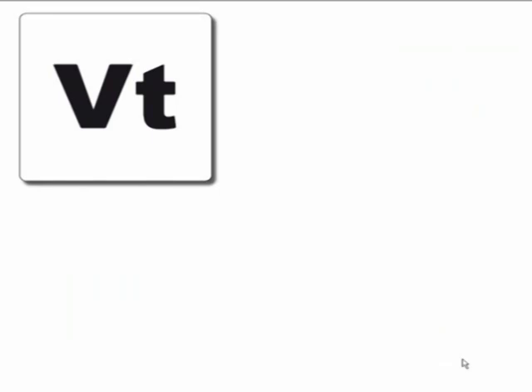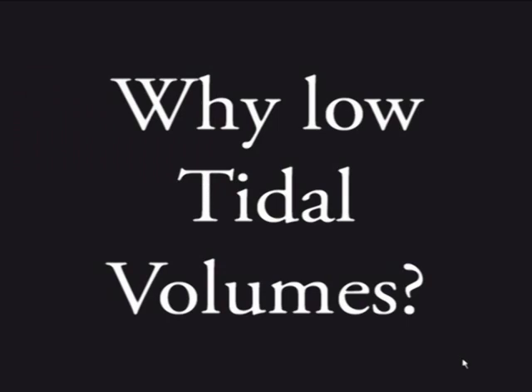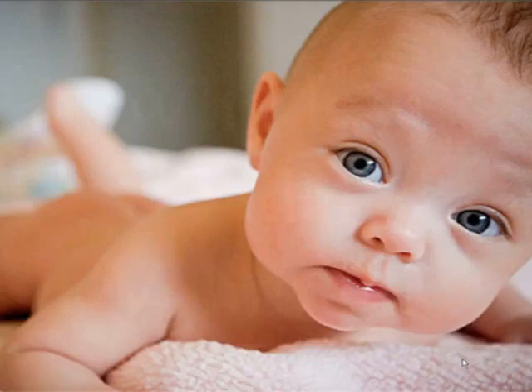And years ago, they used to use very high tidal volumes, and that was injurious. That's where all the lung injury came from. So why do I recommend low tidal volumes? All right, what you have to understand is that injured lungs are baby lungs. And since this was first coined by an Italian, we'll say injured lungs are bambino lungs.